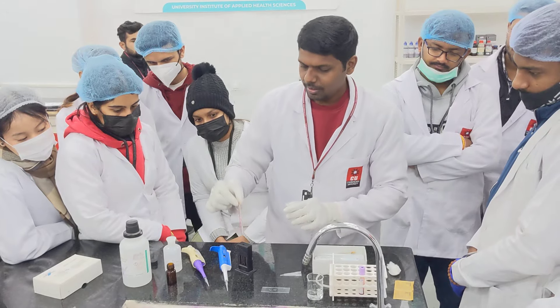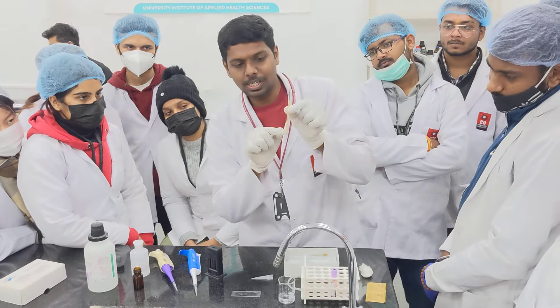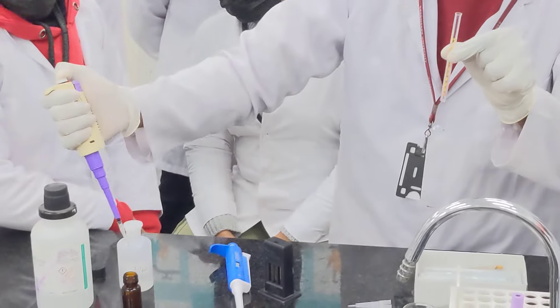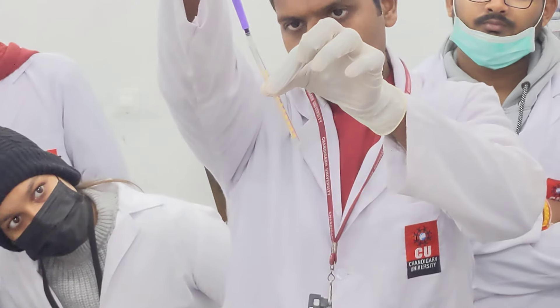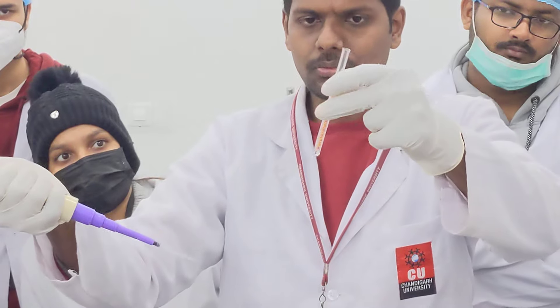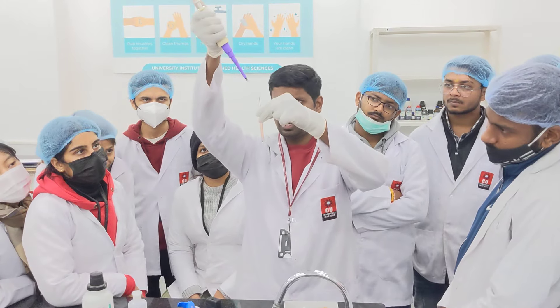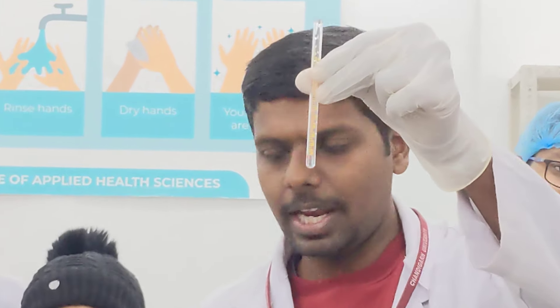The first step is to take N/10 HCl up to the 2 mark in the HB tube. You can see the 2 mark at the bottom. With the help of the pipette, take N/10 HCl. There is a thumb rule of pipetting — the test tube should be at the height of your eyes. So now this is up to the second mark. I have taken N/10 HCl.